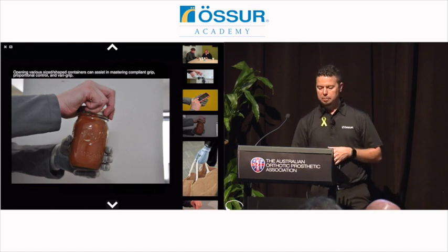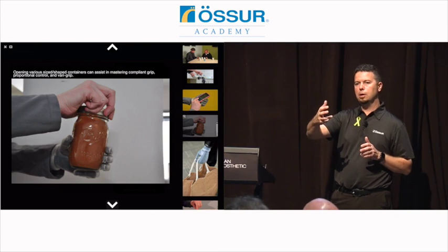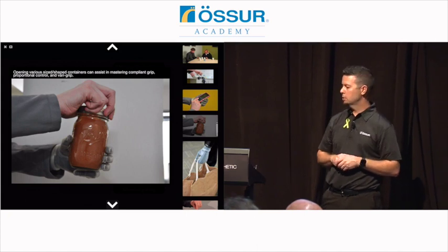What you'll notice about this picture is that that pinky finger is curled underneath the jar. So as they push down on the lid to open it, it provides some extra force as well. Those are some nice tricks to show them.